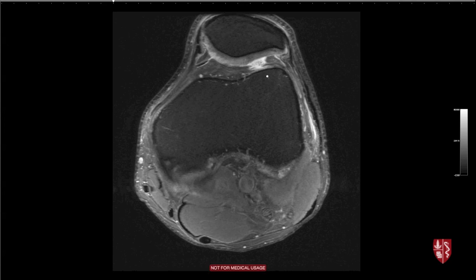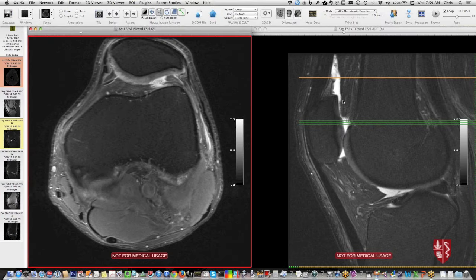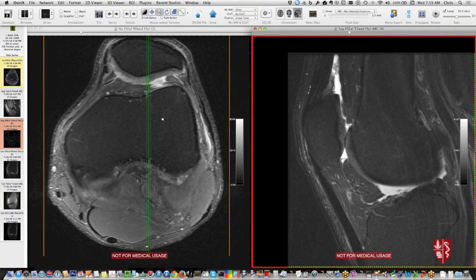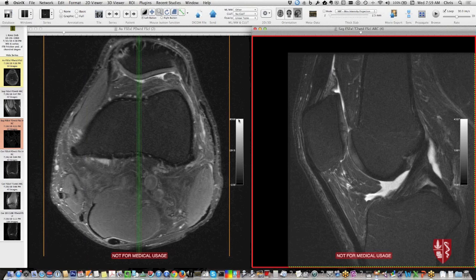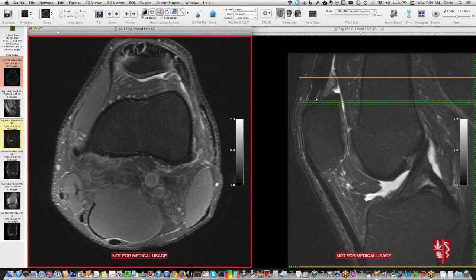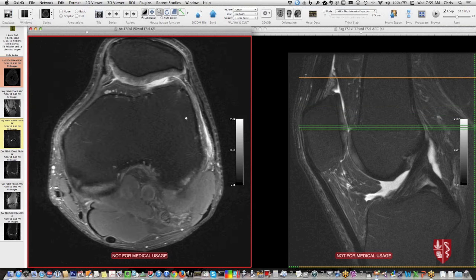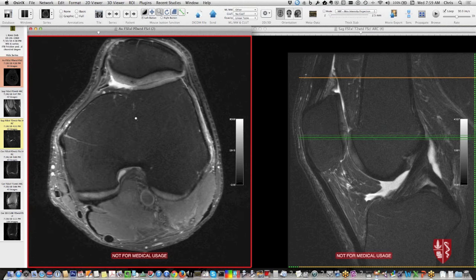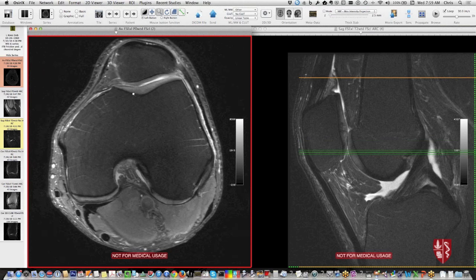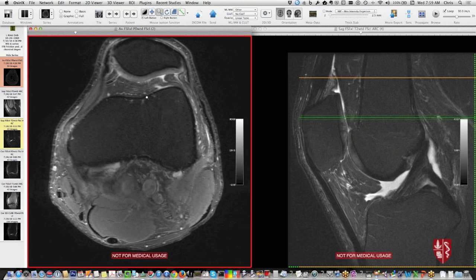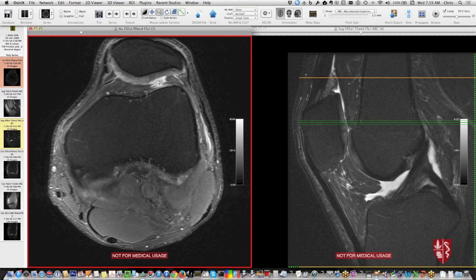An important pitfall on axial patellofemoral cartilage assessment is being too high. If you're at the upper patella level, what appears in front of the femur is pre-femoral fat, not trochlear cartilage. On fat-suppressed sequences that fat is low signal. You don't reach the trochlear cartilage until you go further down. You want to find the gray homogeneous tissue that is the true articular cartilage — a common error is calling a cartilage defect in the trochlea when it's actually just the pre-femoral fat.